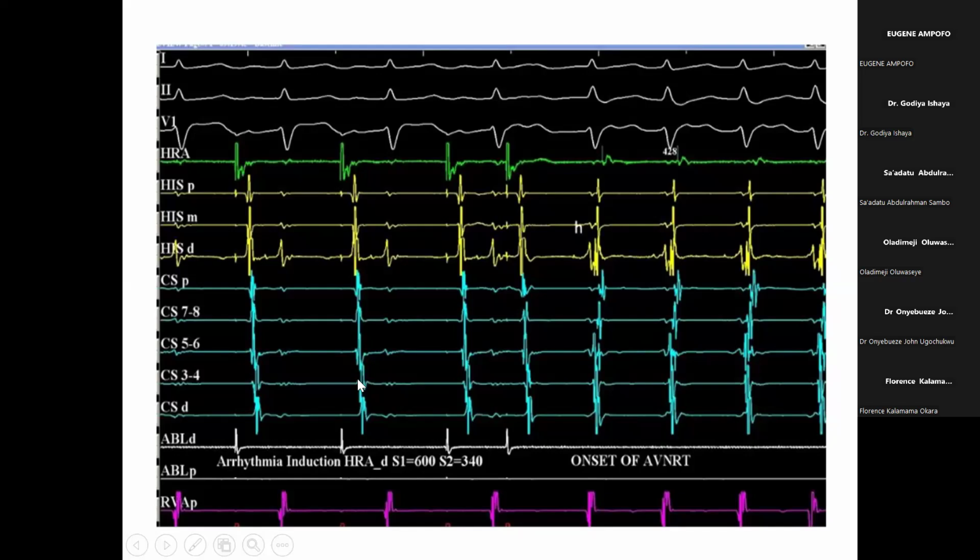Let's say whatever, 600 milliseconds. They've been giving us the time interval, 600. Look at the second time interval. It looks regular now. Between here and here, it also looks like 600. Yes. But the next question you ask yourself is, is it the same interval between this and this? Between the third and the fourth cycle?